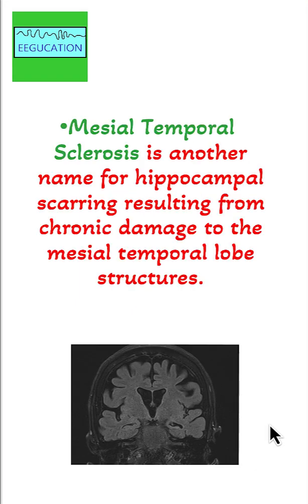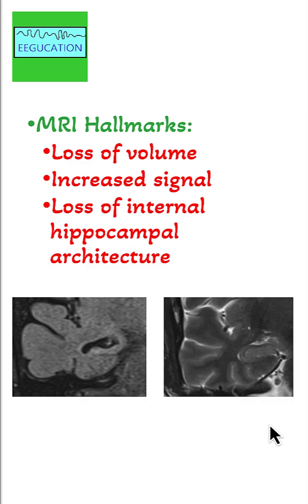Mesial temporal sclerosis is another name for hippocampal scarring resulting from chronic damage to the mesial temporal lobe structures. The MRI hallmarks include loss of volume, increased signal, and loss of internal hippocampal architecture, as you see in this slice here.